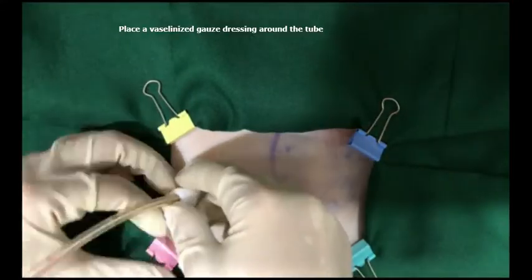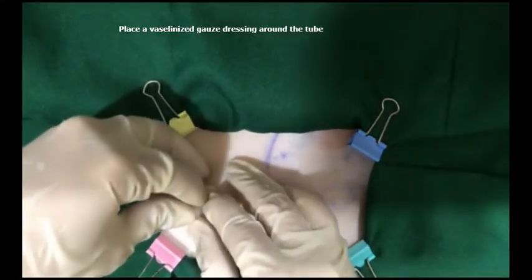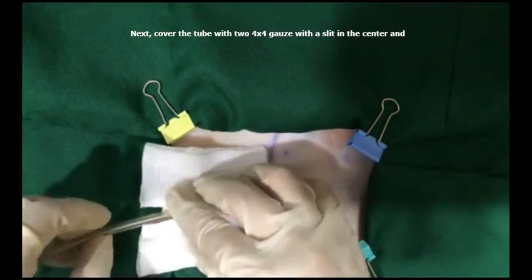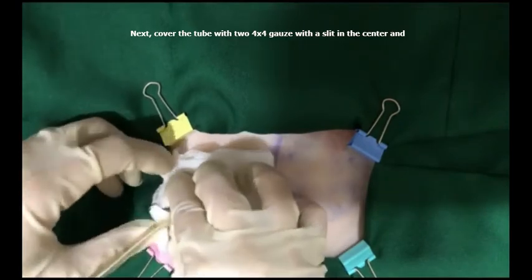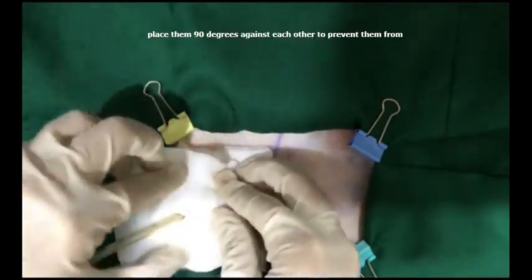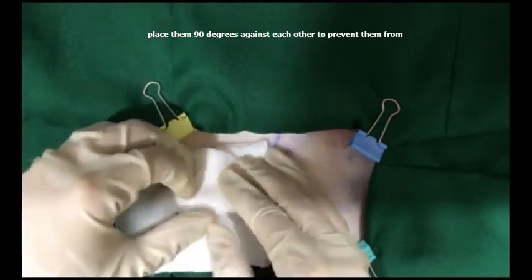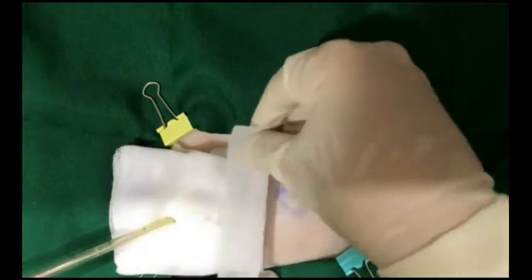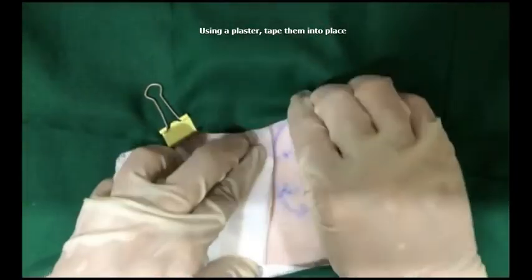Place a Vaselinized gauze dressing around the tube. Next, cover the tube with two 4x4 gauze with a slit in the center and place them 90 degrees against each other to prevent them from sliding up the tube. Using a plaster, tape them into place.